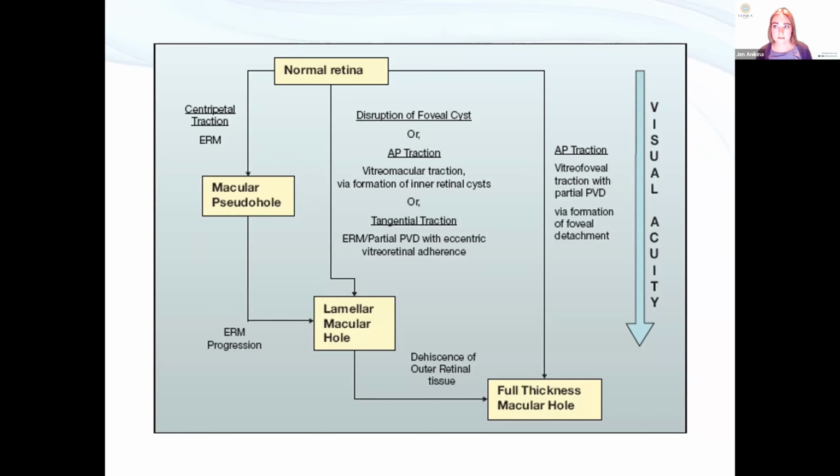We all have a tendency. We love visual things. Ophthalmologists, we adore our scans. We love to be glued to them. You have to actually turn around and look at your patient and think clinically and put all the bits of evidence together. And that's the way to differentiate.